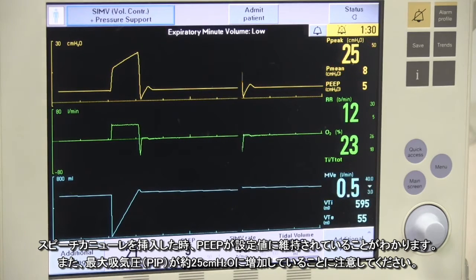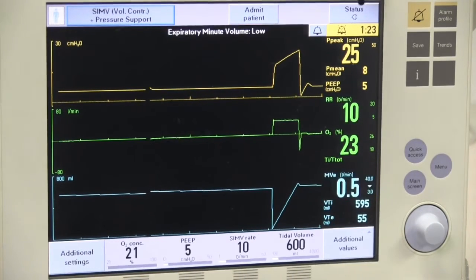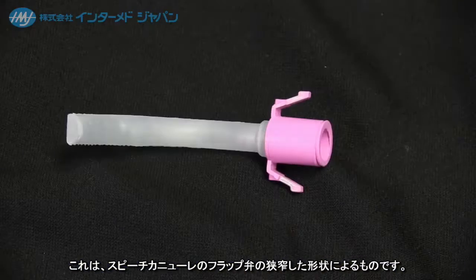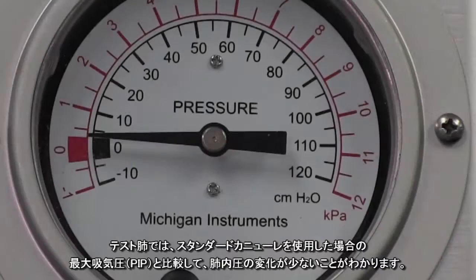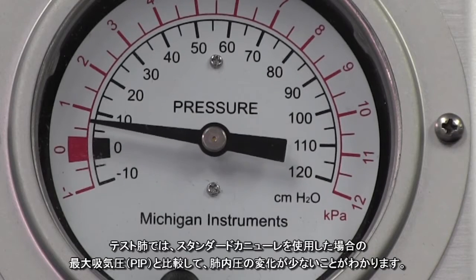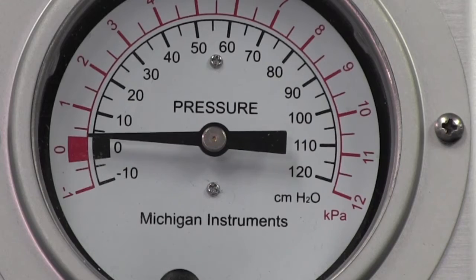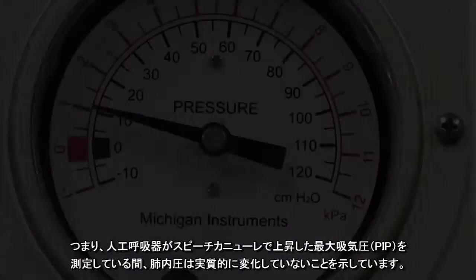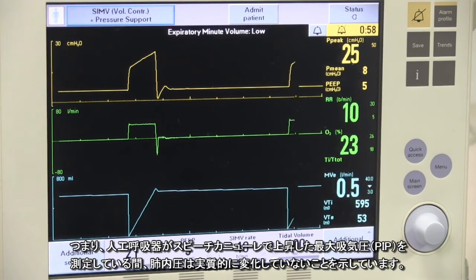You will also note that the ventilator is registering an increased peak inspiratory pressure of 25 centimeters of water. This is due to the narrowing at the flap valve of the speech cannula. However, you can see in our test lung that intrapulmonary change is minimal as compared to the peak inspiratory pressure with the standard cannula. This indicates that while the ventilator measures increased peak inspiratory pressure with the speech cannula, intrapulmonary pressure has not substantially changed.